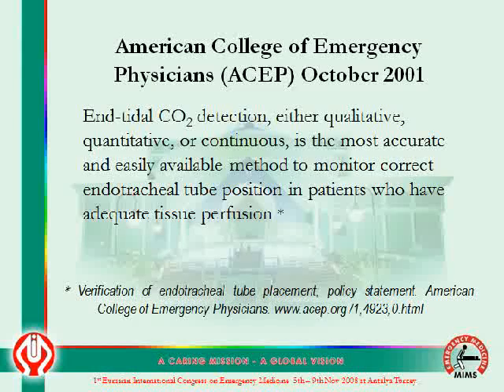The American College of Emergency Physicians, that's the ACEP, in October 2001 placed their policy statement as far as the verification of endotracheal tube placement is concerned. This states that end-tidal carbon dioxide detection, either qualitative, quantitative, or continuous, is the most accurate and easily available method to monitor correct endotracheal tube position in patients who have adequate tissue perfusion.